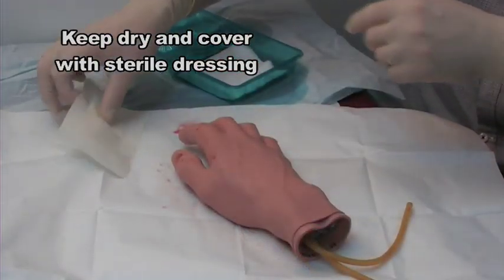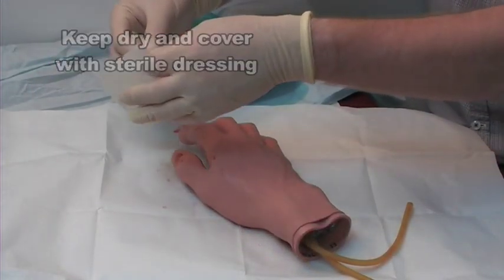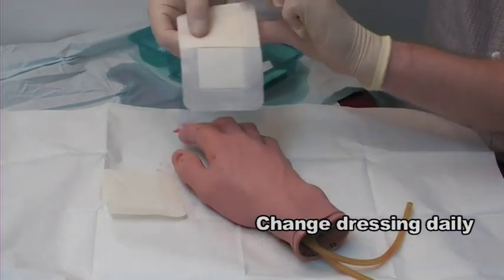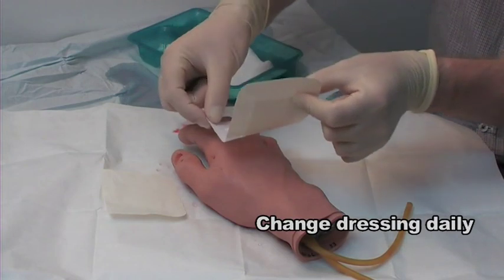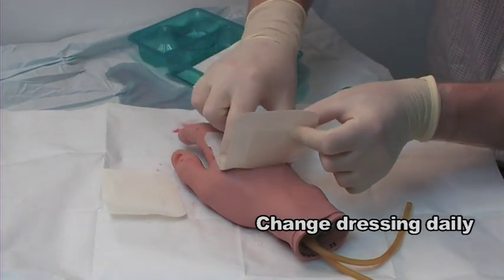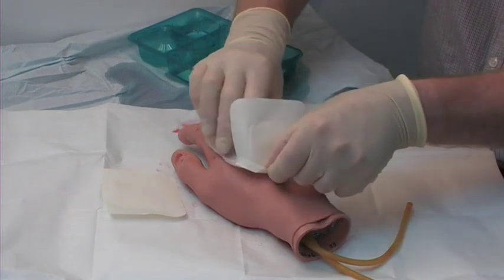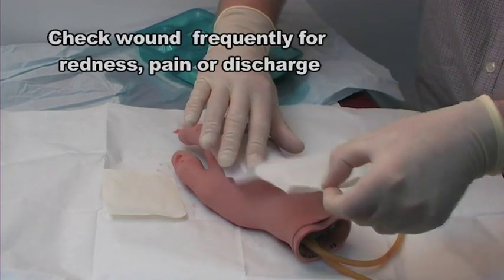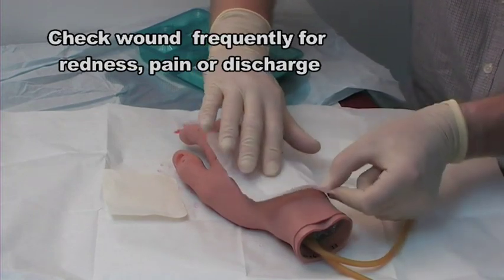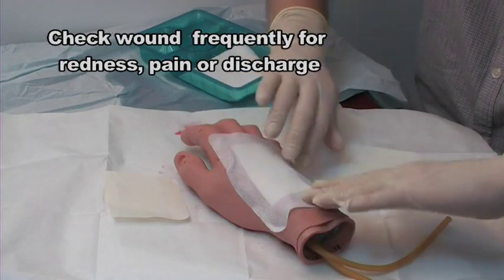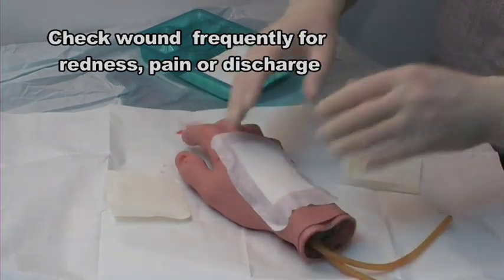The dressing has been opened onto the sterile field and I'm just going to peel the backing of one side without touching the actual dressing part. Apply that first half and then the second part, I just grip and pull down there, affixing the dressing to the wound without actually touching the wound itself.